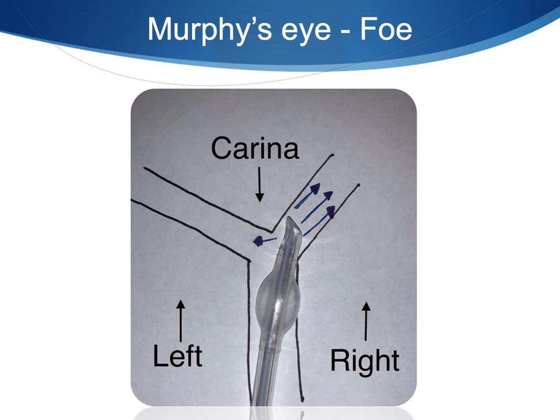If you were listening with your regular stethoscope periodically, you're going to hear the chest and you're going to hear breath sounds on that left side. But what you're not going to realize is that you're actually hypoventilating that left lung.